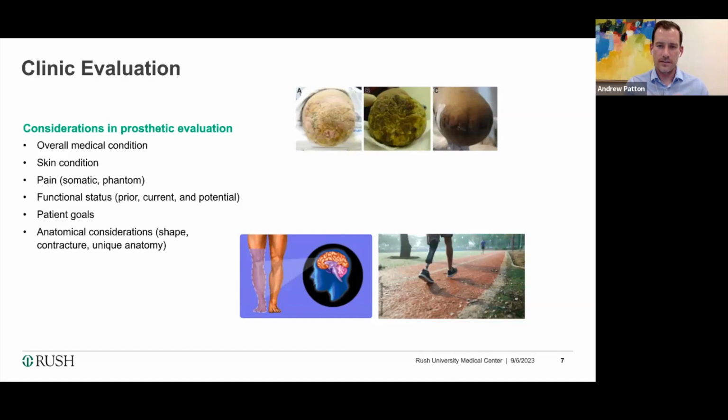And we'll go over a sample of some basic parts of a prosthesis so you kind of know what the setup will end up looking like. But we're not going to get into the weeds about individual prescription of devices or all the various types of things that you can do. I wanted to keep this more of a broad overview.